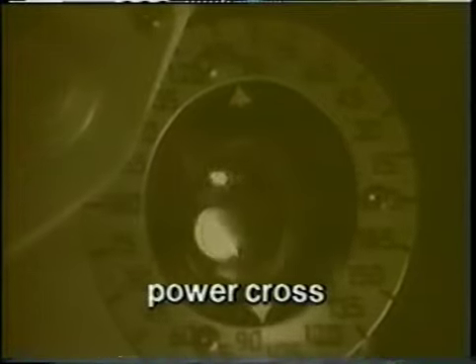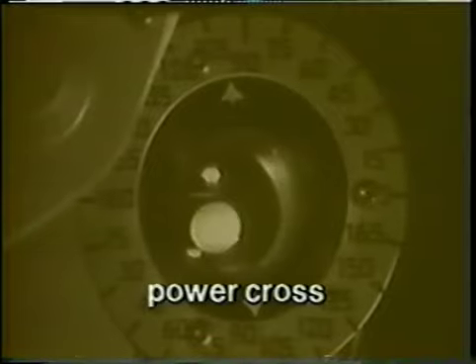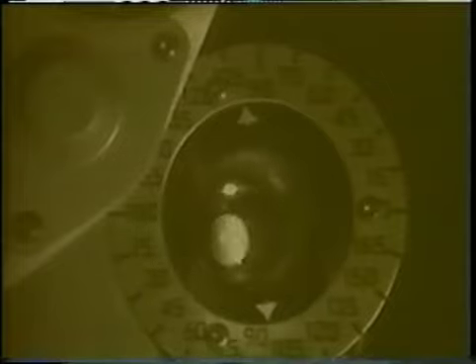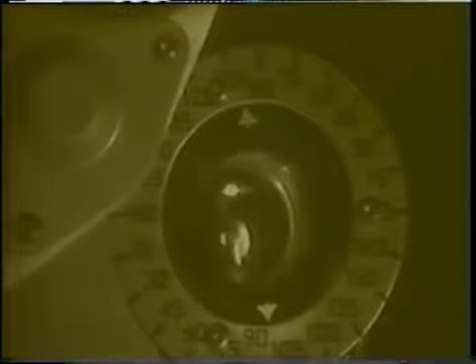We compare the with movement in the two principal meridians back and forth as we slowly move backward to the normal working distance. Here we see that the with movement is unbalanced between the two principal meridians, that we need more plus power to neutralize the streak in the vertical meridian. The vertical meridian is parallel to the cylinder axis, so we need to add more plus cylinder power to decrease the with movement. Like so. We check the power cross again. This time it appears balanced, and it stays balanced as we move slowly outward to the normal working distance.